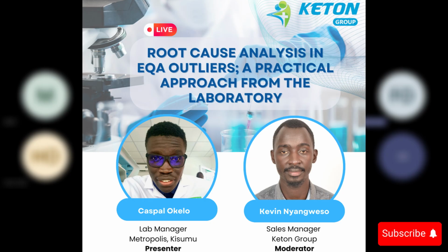The overall score is acceptable, but if you look at the range and the lab results and the range, it's telling you these are failed, a failed run or a failed EQA. So one of the things guys need to pay attention to in their EQA summary report is not the overall outcome. Yes, the overall outcome is fine, you've passed, but you've passed at what level? Just a contribution there.